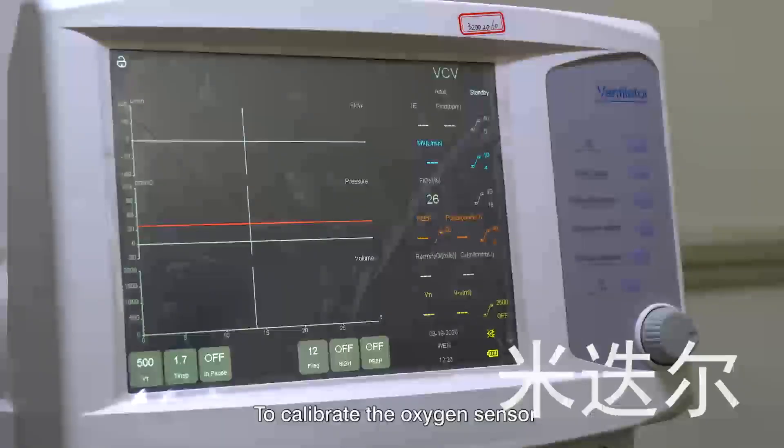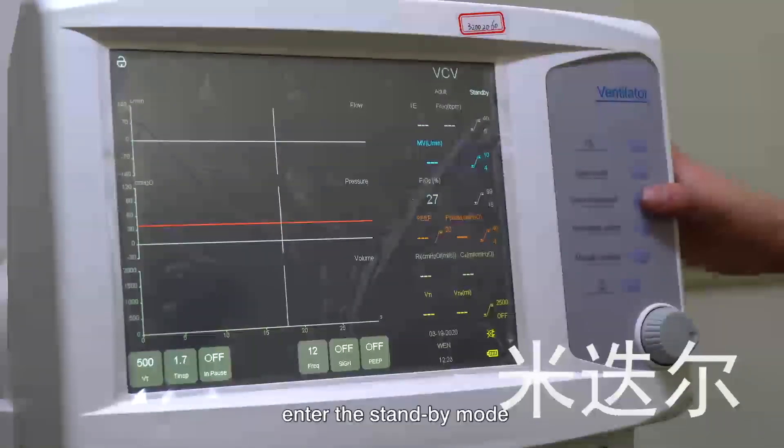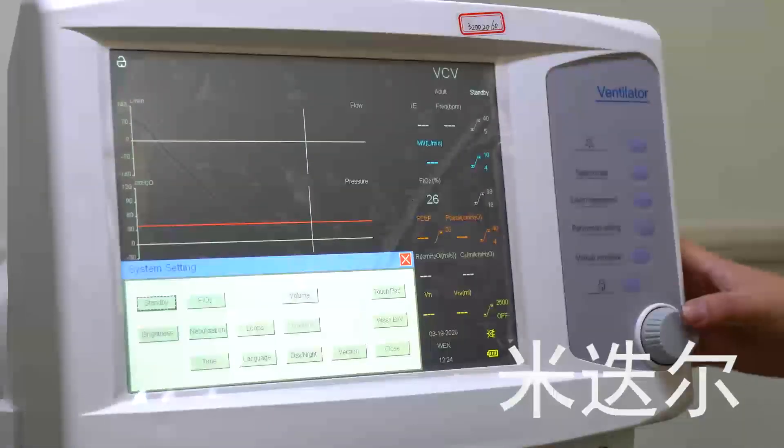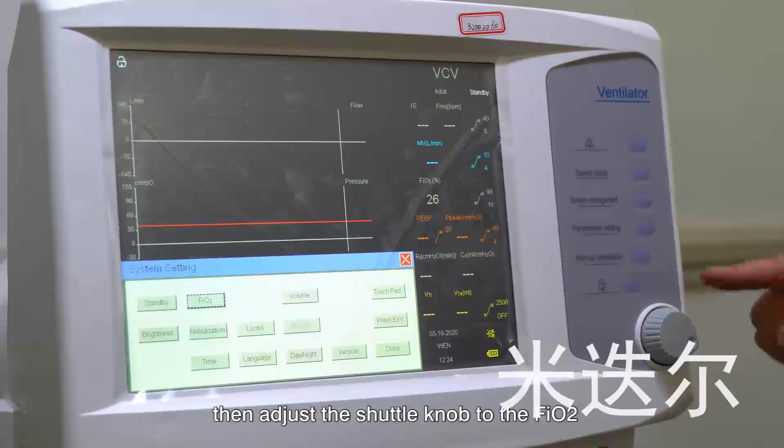To calibrate the oxygen sensor, enter the standby mode, then press the system management. Then adjust the shuttle knob to the FiO2, press and the machine will automatically recalibrate the sensor.